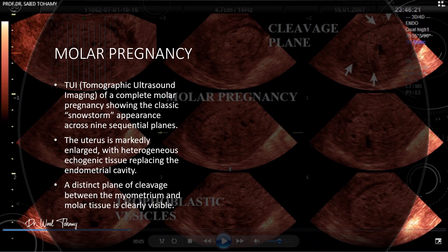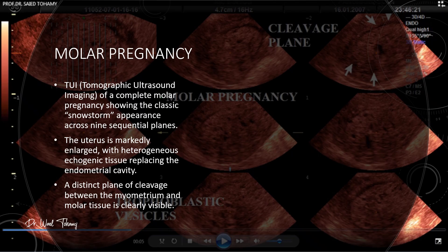Here is a TOI — tomographic ultrasound imaging — of a complete mole pregnancy. Across nine sequential planes, you can see the classic snowstorm appearance. The uterus is markedly enlarged and the endometrial cavity is completely replaced by heterogeneous echogenic tissue. Look carefully — you can clearly make out the plane of cleavage between the myometrium and the molar tissue. Spotting that interface is an important clue in confirming the diagnosis.